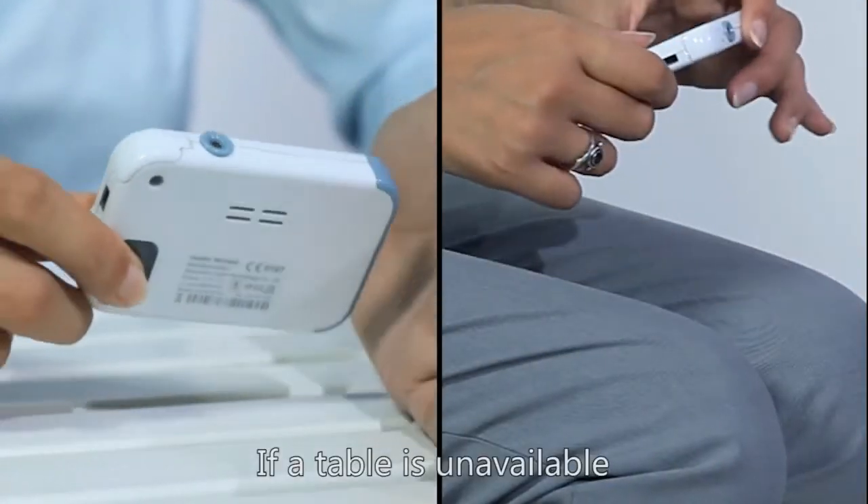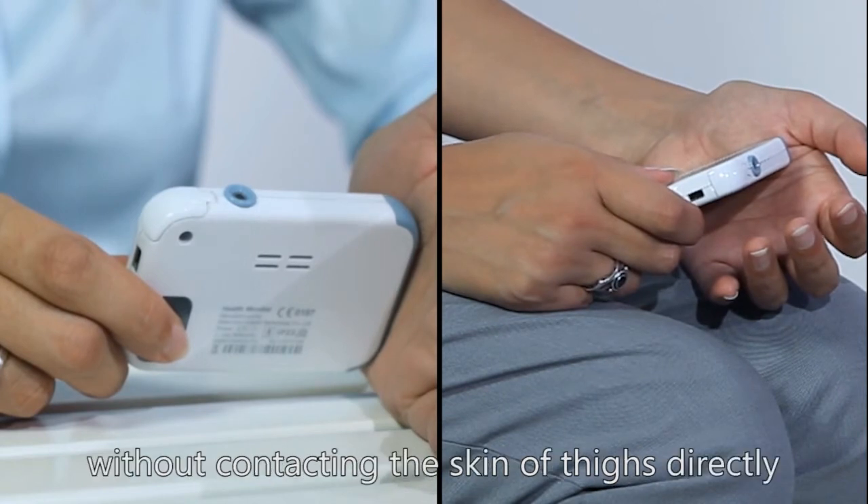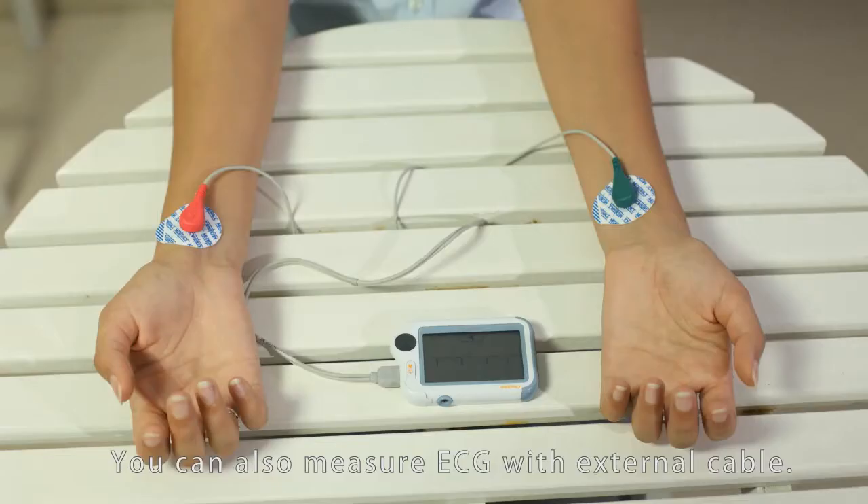If a table is unavailable, rest your hands on your thighs without contacting the skin of the thighs directly. You can also measure ECG with an external cable.